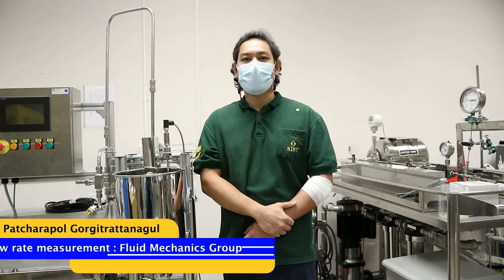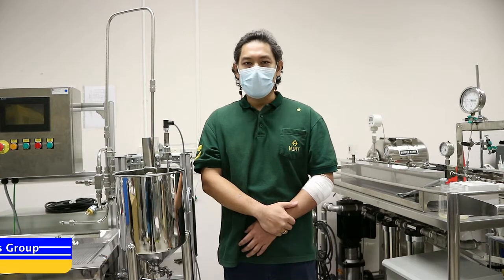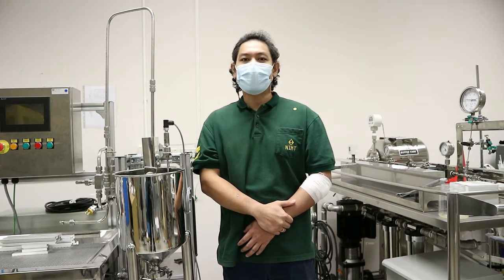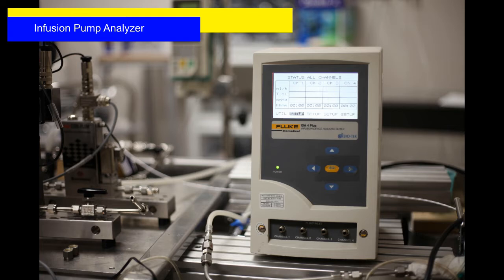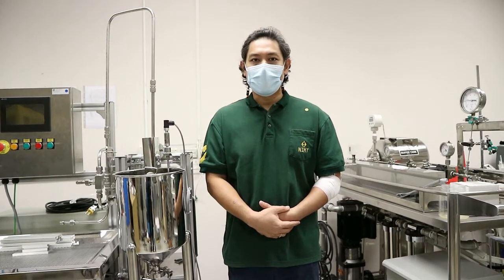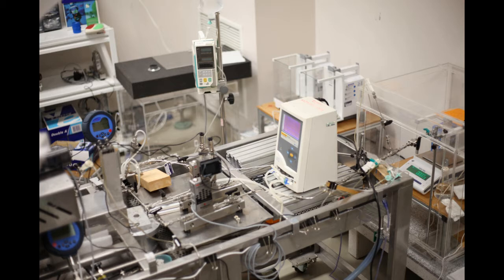The performance tests of infusion pumps include flow rate accuracy, volume accuracy, and occlusion pressure. There are two main performance tests of infusion pumps, flow rate and pressure. The analyzer will provide flow rate measurement accuracy at 1% of reading. Since that, the calibration facility CMC has to be designed for less than 0.33% of reading. In other words, 1/3 of accuracy. That's the rule of thumb.